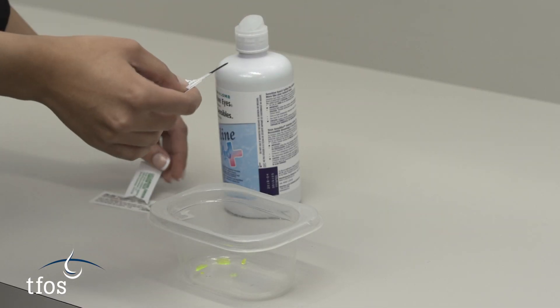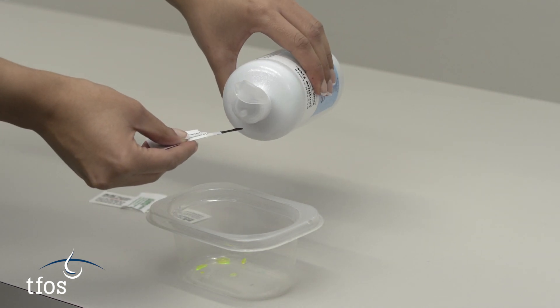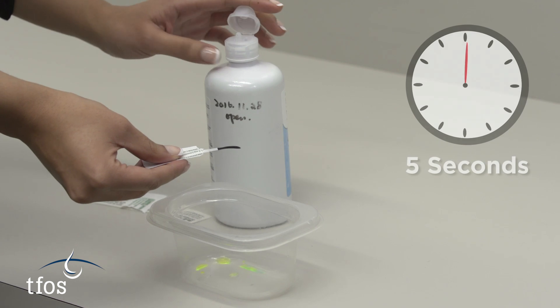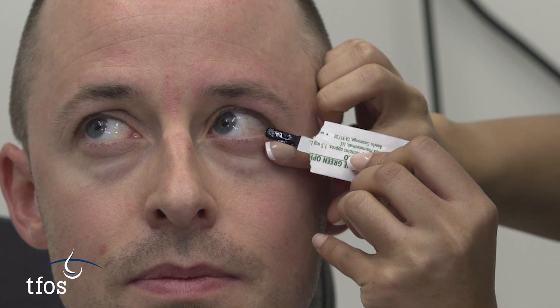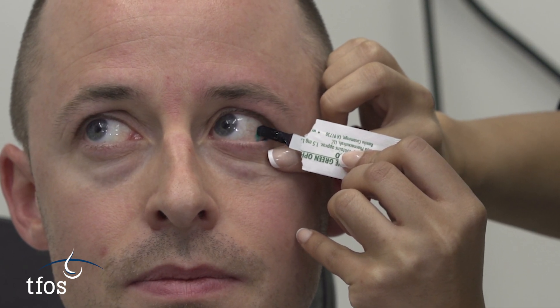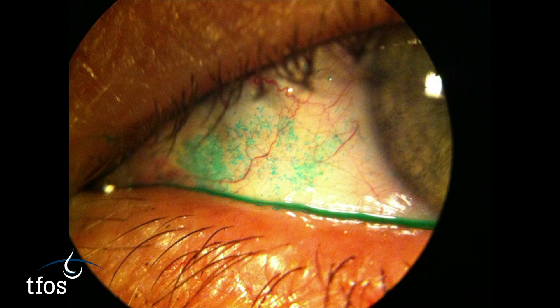Conjunctival damage is best highlighted with the installation of lissamine green. The dye strip is wet with saline and should be allowed to soak into the strip for at least five seconds for the dye concentration in the fluid to increase. The whole drop is then applied inside the temporal canthal area while the patient looks up. The conjunctiva should be viewed one to four minutes after installation of lissamine green.